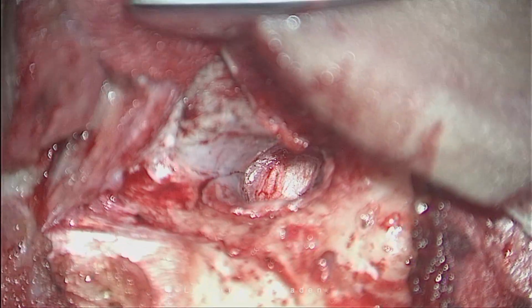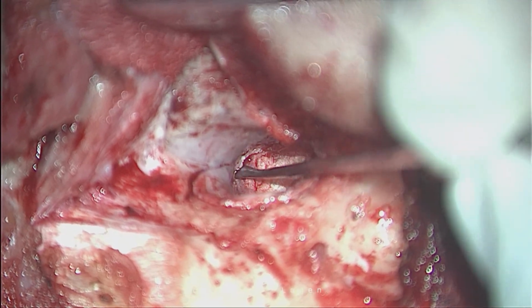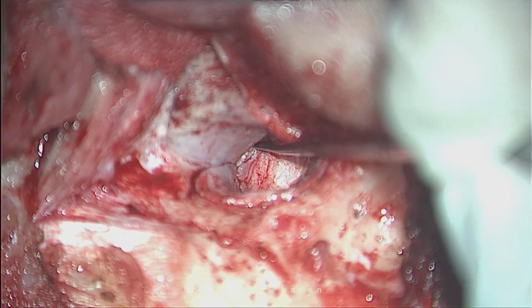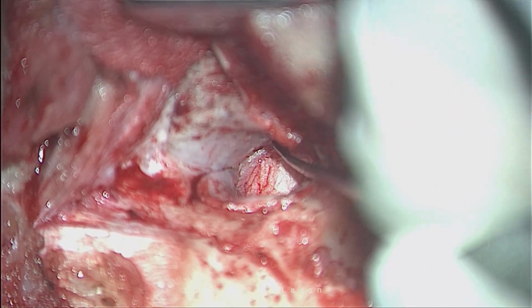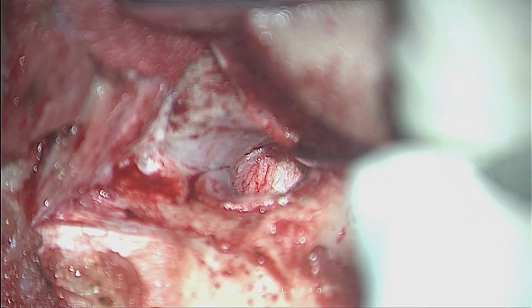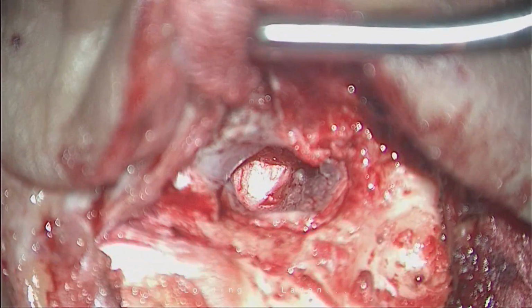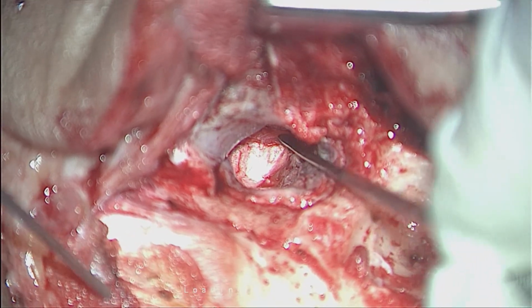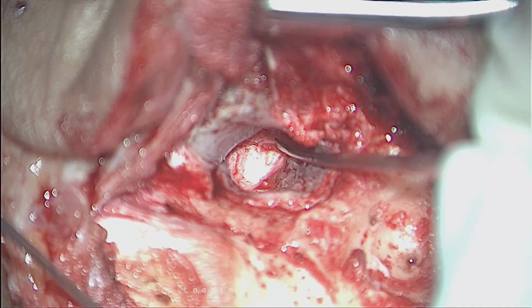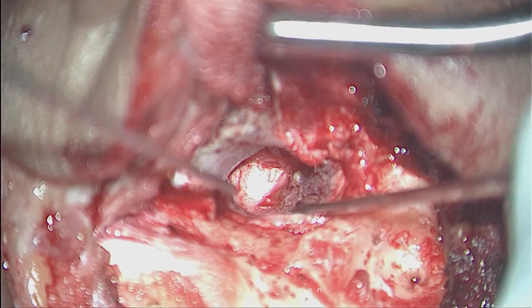So this graft remains absolutely tension free right on the annulus. See this, I am pressing into the annulus. This is a fresh graft. You can see the color of the graft. See the anterior superior margin. Nowhere is the graft under tension.